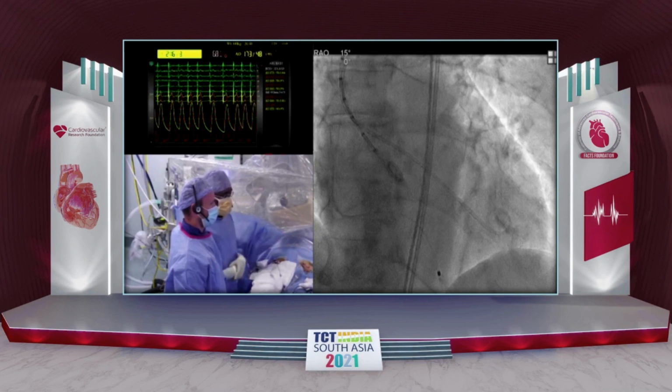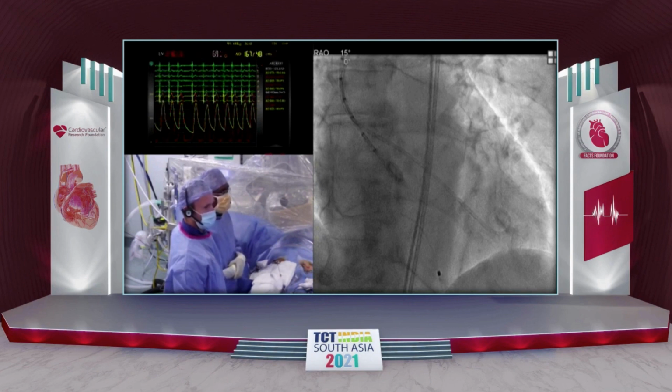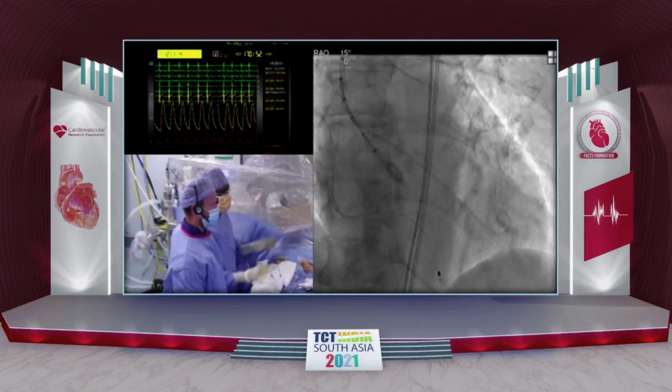Dr. Ganesh, I think you are saying the same indications as a CoreValve, but it is better positionable or has some advantages with this newer system? Well, in terms of deliverability, this is definitely superior to any valve I've touched so far. The deliverability of this technology is really out there compared to any other technology.